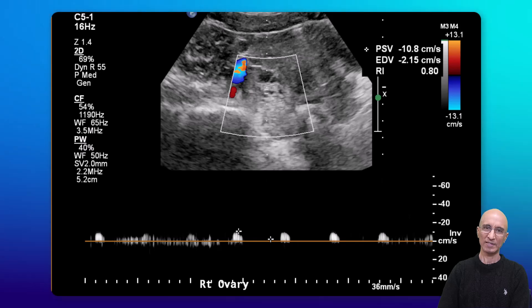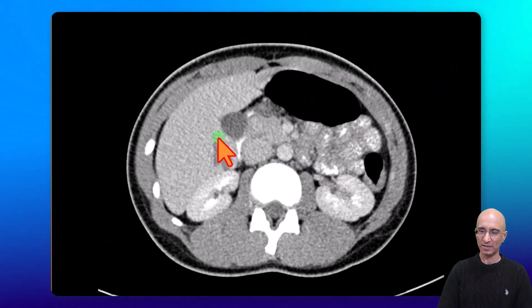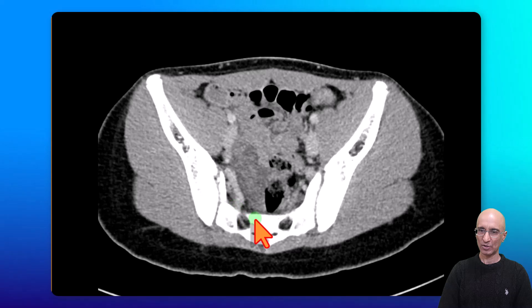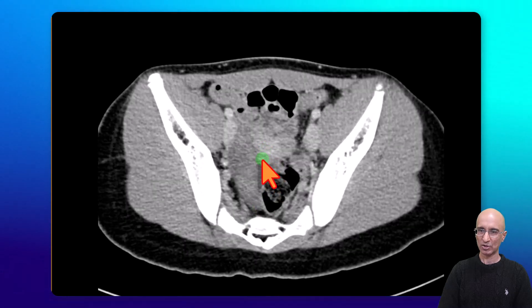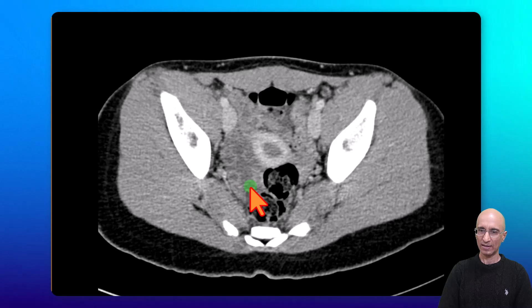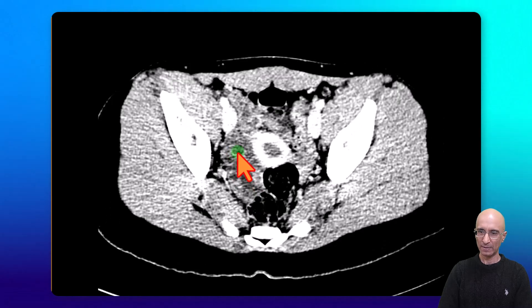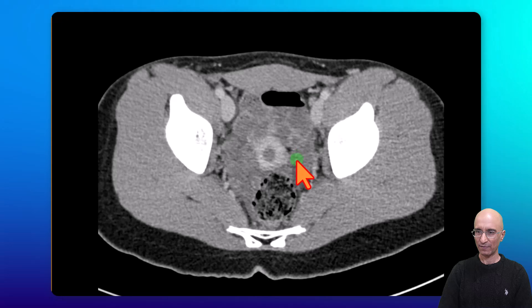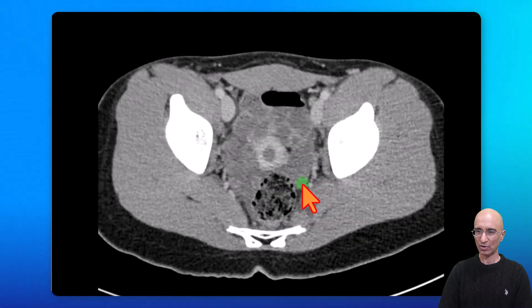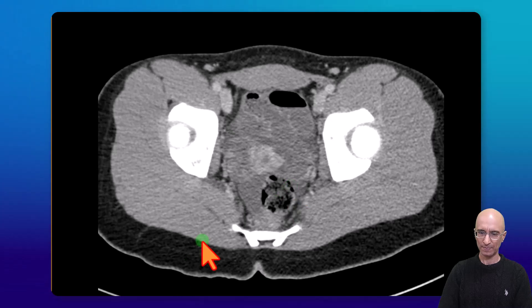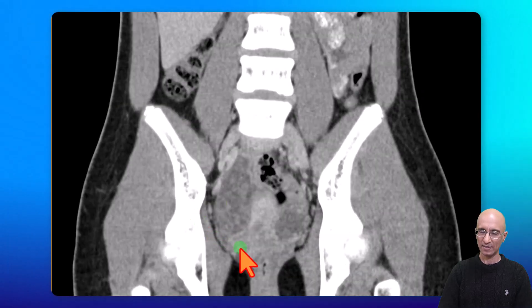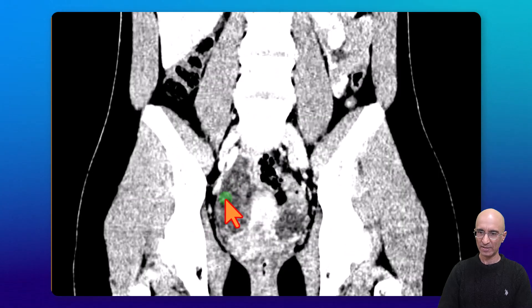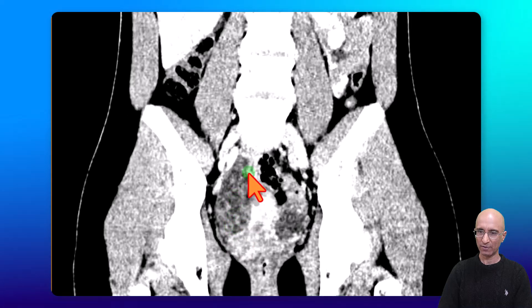The patient subsequently underwent CT examination. On the CT examination, the upper abdomen was unremarkable. As I scroll down to the region of the pelvis, we can see a soft tissue lesion in the right adnexa which appears to be posterior to the uterus, and we can see edematous stroma with peripheralization of the follicles. Contrast this to the left adnexa where we have a normal-sized left ovary with few follicles. We can see similar findings where we have a large soft tissue mass in the right adnexa which has central stromal edema with peripheralization of the follicles.